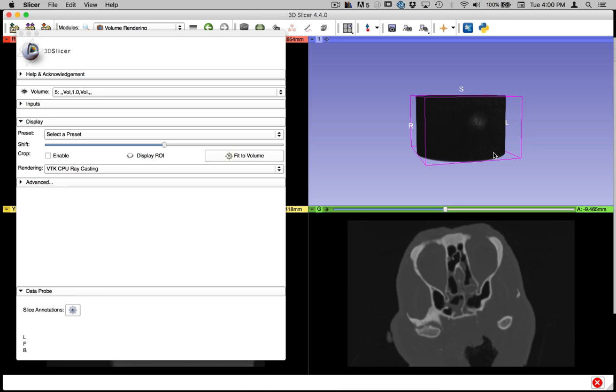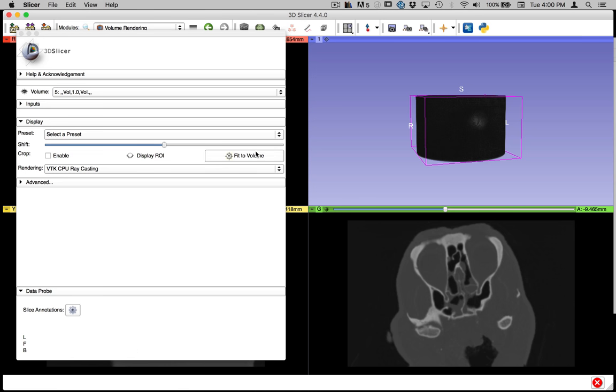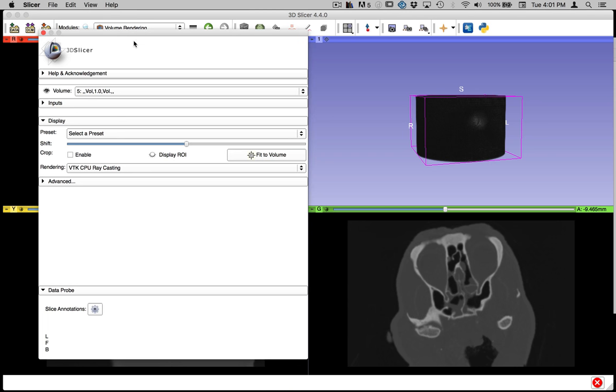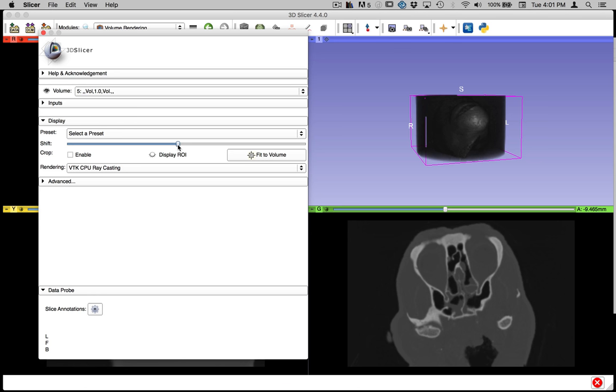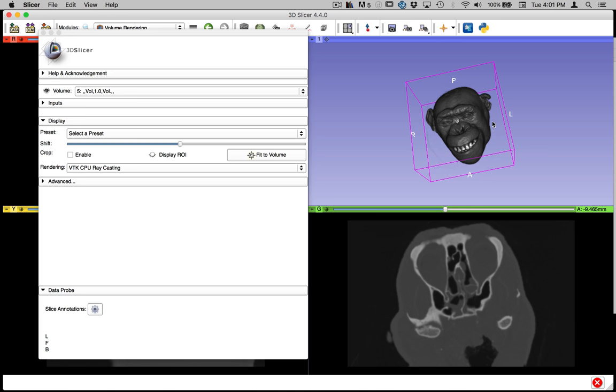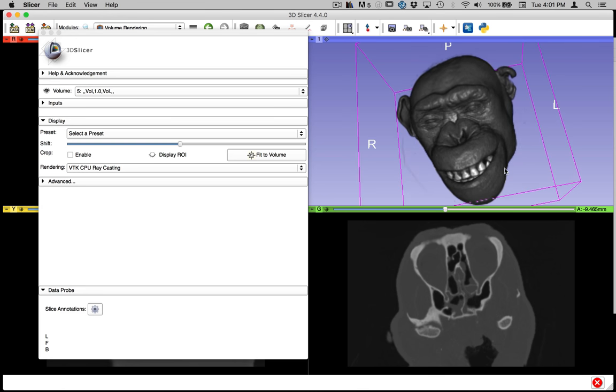So what we're seeing is a volume of space that's representing those different density differentials. And where we look at a 2D image and see pixels, when we look at a 3D image like this that's space-filled, we see voxels. If you play Minecraft, you're probably familiar with that. So if we want to take away all of this part in the cylinder, so this chimp's head was in a cylindrical space, and the air is even being represented by voxels now. So here in the volume rendering module, if we just start to drag this shift slider, we can change what's included and excluded. So I'm going to pull it over to the right, and you'll start to see the air starting to disappear, just leaving us with the soft tissue of the chimp.